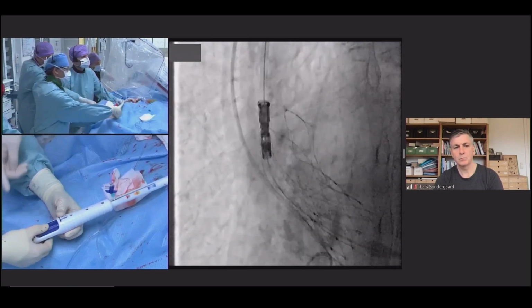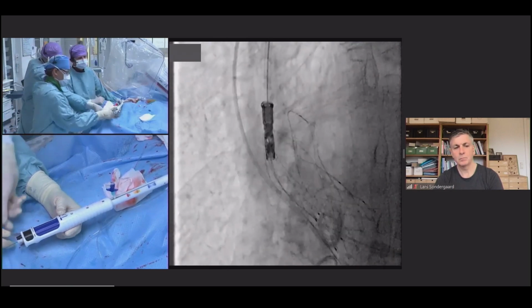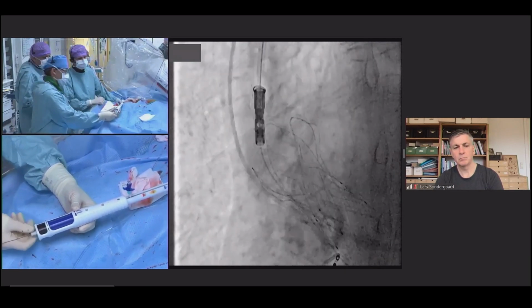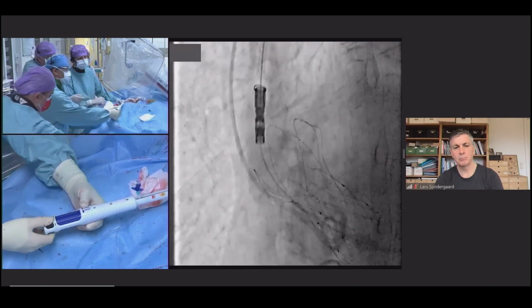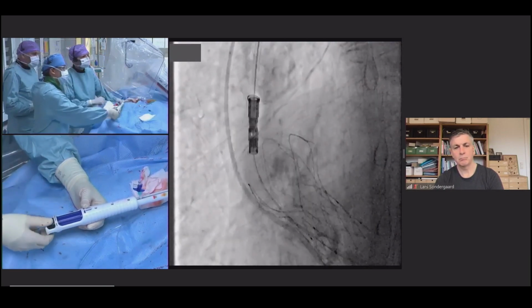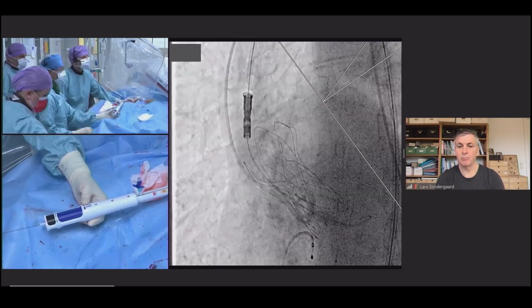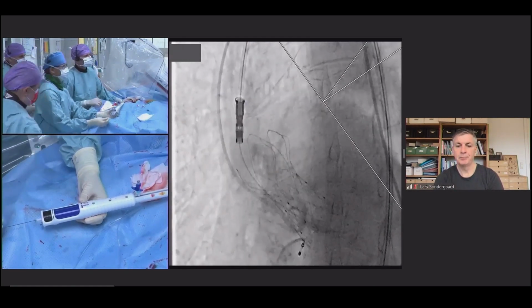So if you rotate the black one here counterclockwise and take that screw off, totally off, pull it out, and you go counterclockwise on the black one. Oh, it's free. That's a way to bring it free. So it came off here. Yeah, it really helps. Good. I think we're ready to come out.